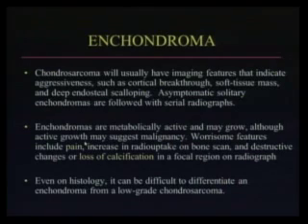Clinical follow-up is key. When I took the boards, the question was, the most reliable finding for malignant transformation was clinical symptoms, like pain. You may also see the chondroid matrix, and in the follow-up the matrix disappears, and that means there is aggressive transformation. Very good. As you can read here, loss of calcification, pain. You may have some endosteal scalloping, but you don't want to see much, okay? If you see that the cortex is very thin, you may think there is a malignant transformation.